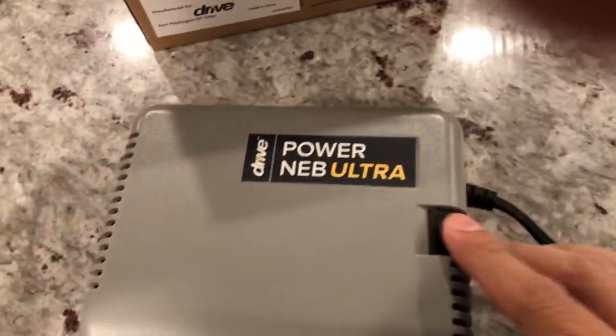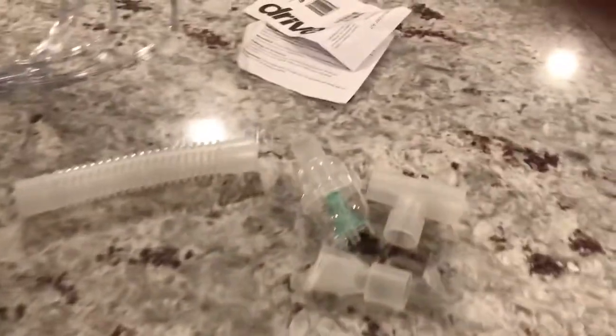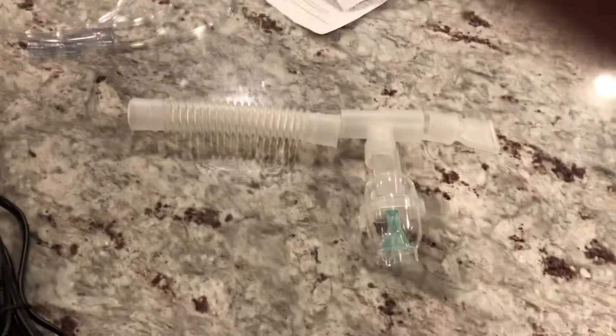So you've got the main unit here with an on/off switch, and this is where the tubing goes in on this side. These little filters came with the package, so one of these should go in here. There's the tubing, and this is probably the medicine cup and the connector. I think it goes like this — this is the medicine cup and this is the mouthpiece. I'm not an expert by any means, but I'll read the instructions and figure it out.